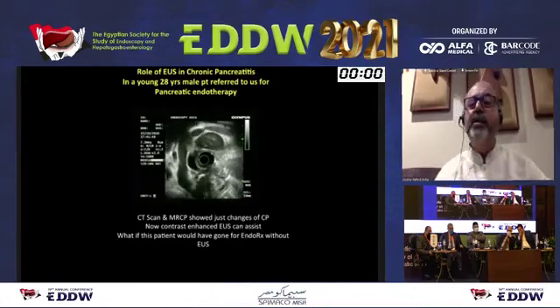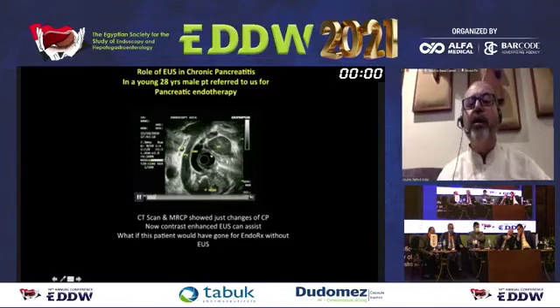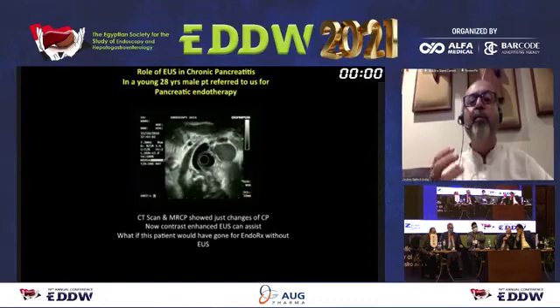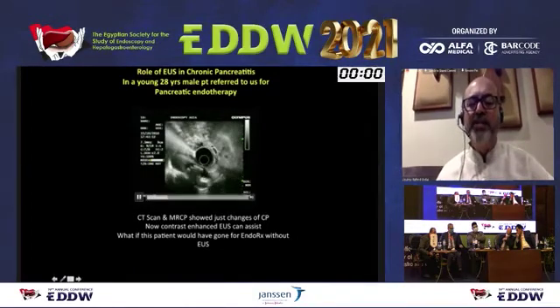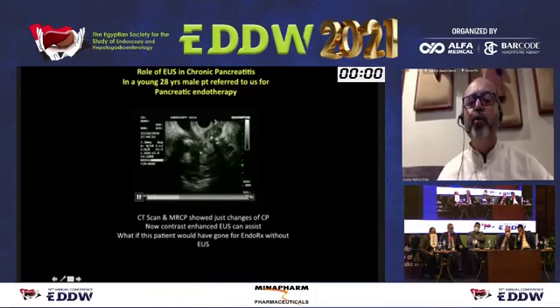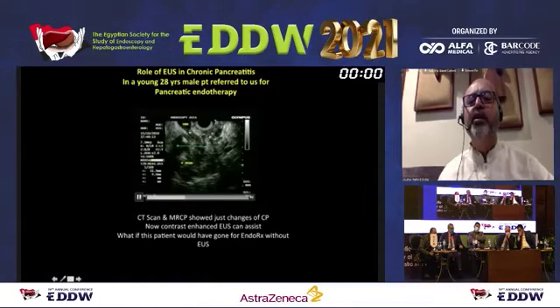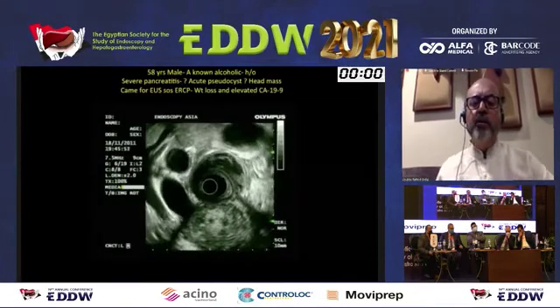Now coming to chronic pancreatitis, as we do a lot of chronic pancreatitis endotherapy, whenever a patient has chronic pancreatitis with jaundice, all of you should have a heightened awareness of the possibility of a tumor in the setting of chronic pancreatitis. And this is exactly what we found in this young man of 28, where we found an irregular tumor in the head of the pancreas, a dilated pancreatic duct you can see on EUS. And this is the hypoechoic lesion causing abrupt narrowing of the bile duct you can see here. And this turned out to be an adenocarcinoma in a setting of chronic pancreatitis.